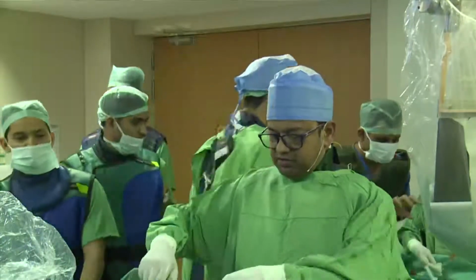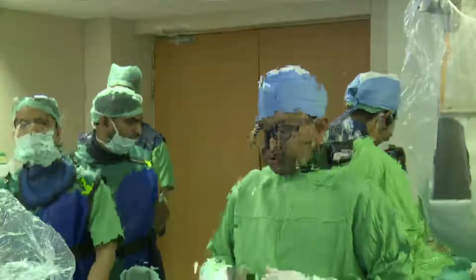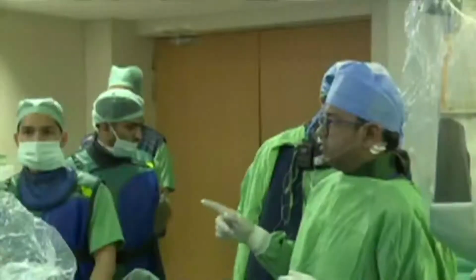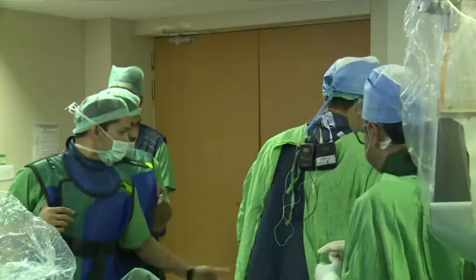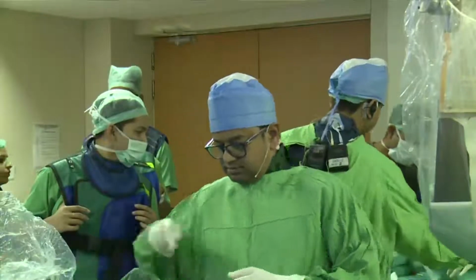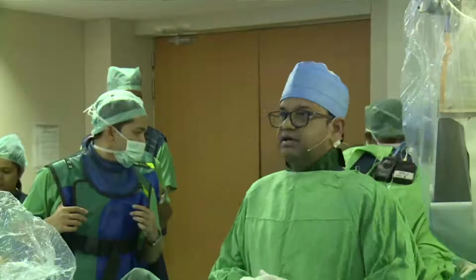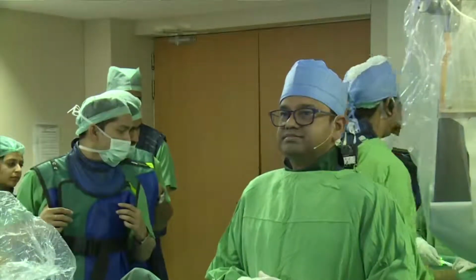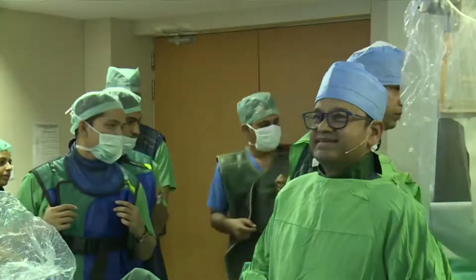So we are planning to do an FFR post-procedure because the OCT looks quite satisfactory. Can we equalize that with the FFR wire? That's very interesting because according to Professor Nico Pijls, we should aim for a fractional flow reserve above 0.9 post-procedure. So good luck with that. We'll take 2 minutes. 5 ml and a drop here. Yes, let's try. Just add 1 ml more, 1 ampule.